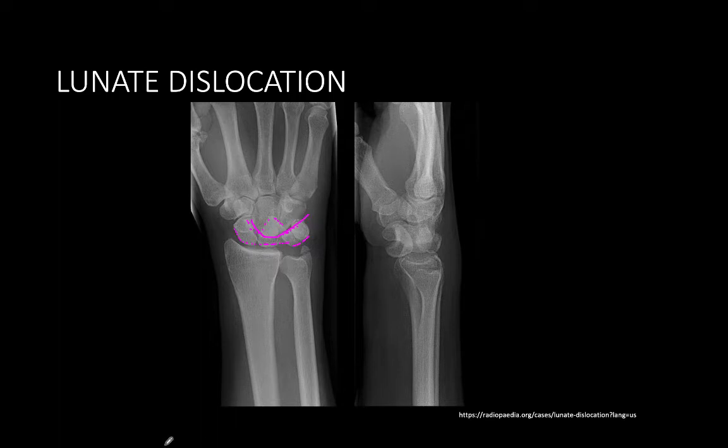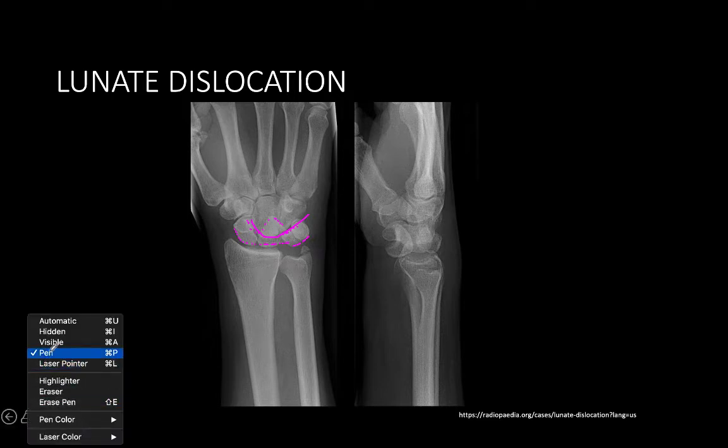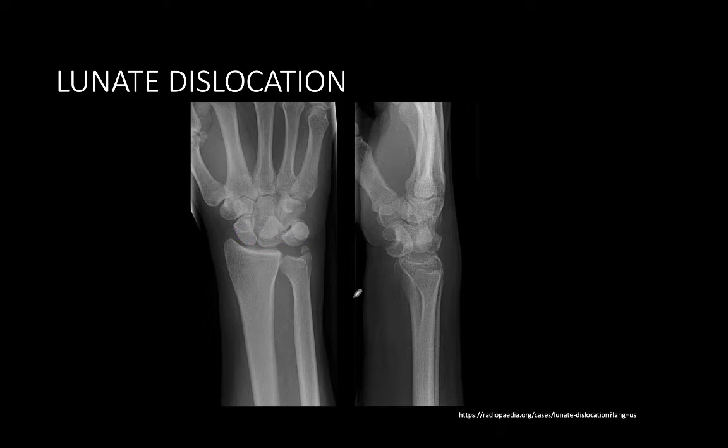Now, when we go to look at the carpal alignment from the lateral perspective, the most important thing is to find the stack of the lunate followed by the capitate. So when you look at carpals from a lateral perspective, the lunate should be sitting in a U-shaped position and the capitate should sit on top of it. And then of course the scaphoid kind of peeks its nose out, right, on the ventral side.